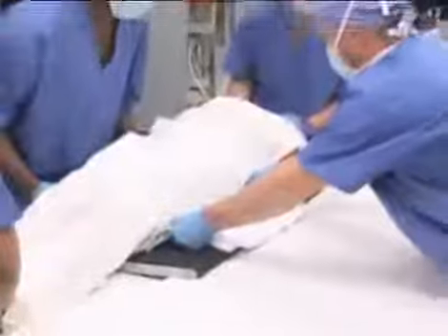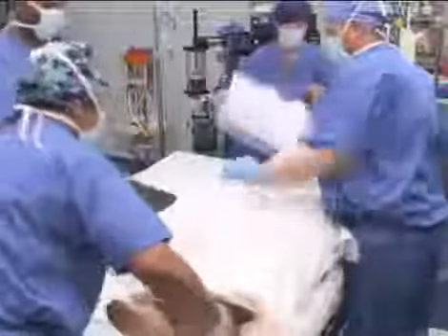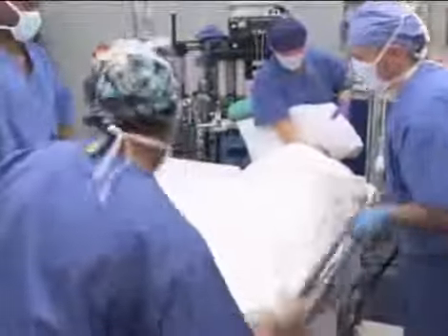The transfer board is placed to the back side of the patient, and those supporting the patient gently ease him or her back into the supine position on the board. By grasping the board and pulling it across the stretcher, personnel can easily transfer the patient to the stretcher. Whether the patient is conscious or unconscious, the same precautions are used when moving the patient to or from the operating table.